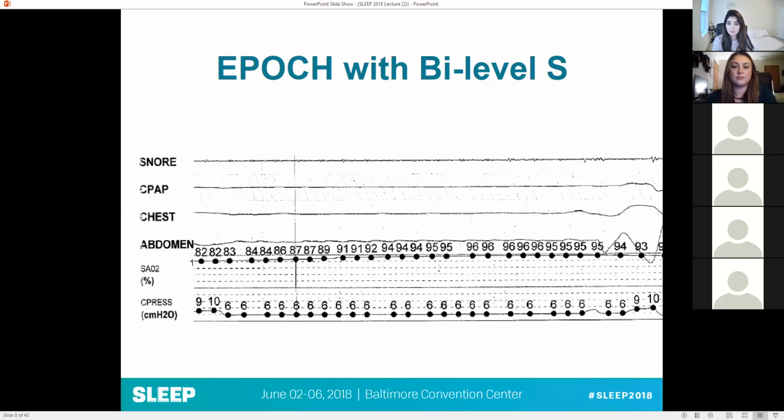An obstructive apnea, you wouldn't see any airflow, but you would see the chest and abdomen moving because there would be ongoing respiratory effort. The airway would just be completely shut down and collapsed, and so air couldn't move in and out, despite the patient making an effort to do so. A lot of times it's actually very vigorous, where the patient's really working to try and pull that air into their lungs, and it's just not working because their airway has collapsed.